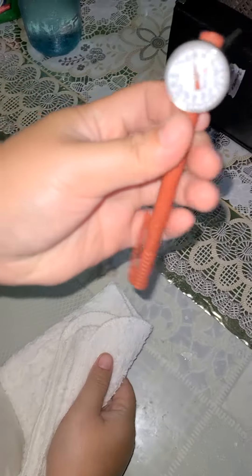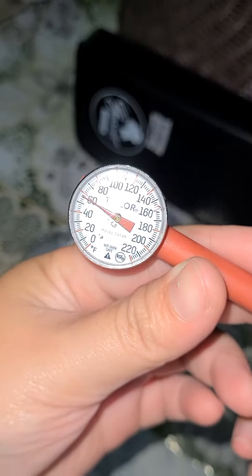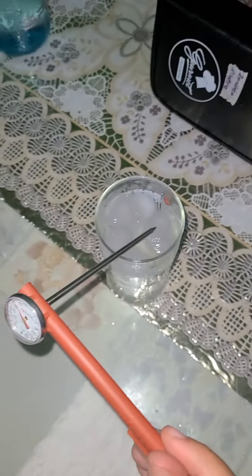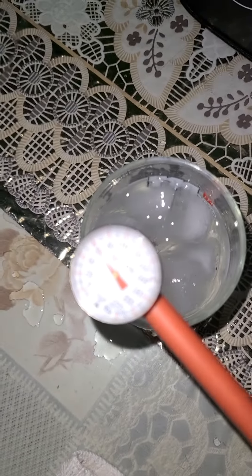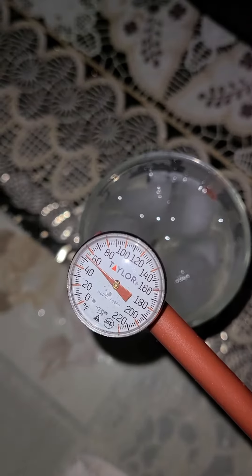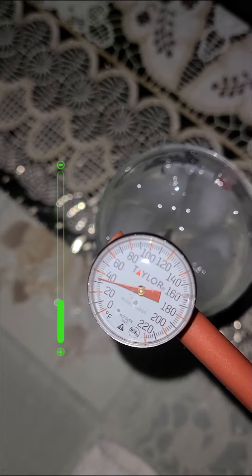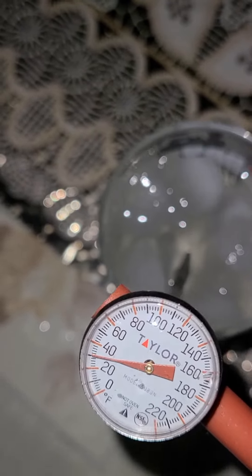After that, take the thermometer out of the glass and look at the meter going up, which means it is reacting to the temperature of your surroundings. Once the meter stops moving, put the thermometer back in the iced water. If the thermometer is successfully calibrated and is now accurate, it should read 32 degrees Fahrenheit, which is the temperature of the iced water.